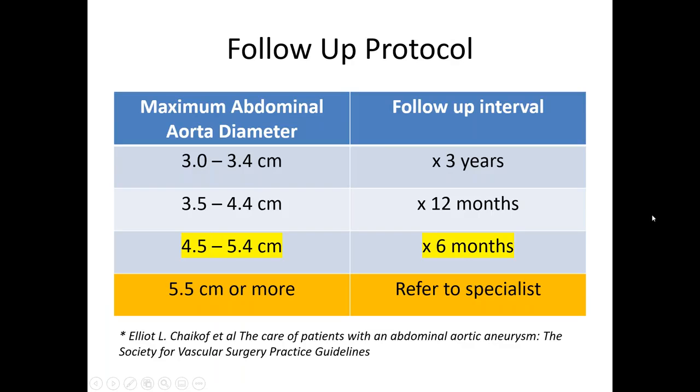For the follow-up protocol, this was published, and every organization might have its own protocol. You can see here 3 to 3.4 is every 3 years, 3.5 to 4.4 every 12 months, and then 4.5 to 5.4 every 3 to 6 months. And of course, 5.5 is a very high risk of rupture, so definitely you want to refer to the specialist.